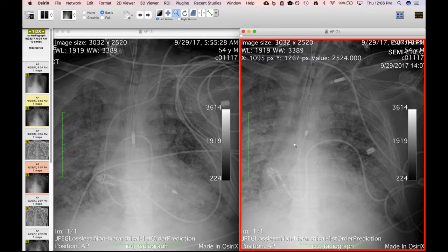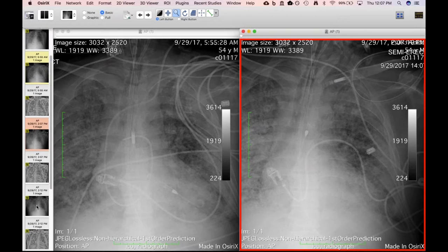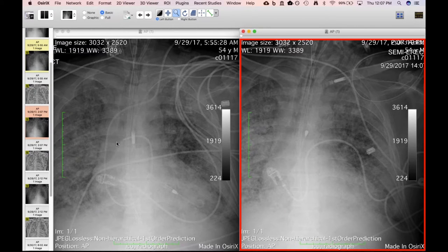has been dislodged. Now we've talked, I know Howard has shown cases of Impellas before, and these have differential pressure sensors so that the computer that this is hooked up to knows if this is across the aortic valve or not. This is of course the part you want in the left ventricular cavity. And so clearly this has been pulled back into the aorta. And what's interesting about this is that it was intentionally pulled back. This was not dislodged by accident. And I thought that was what was very interesting.